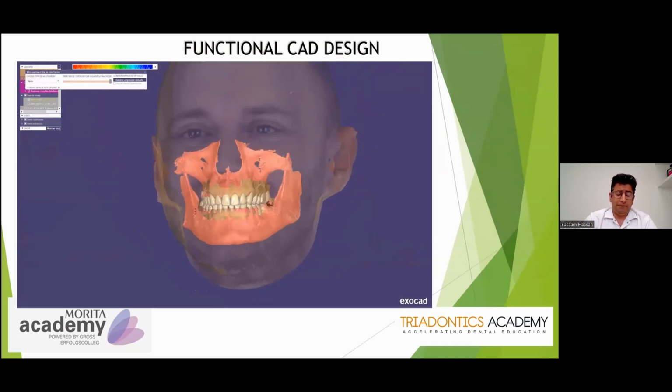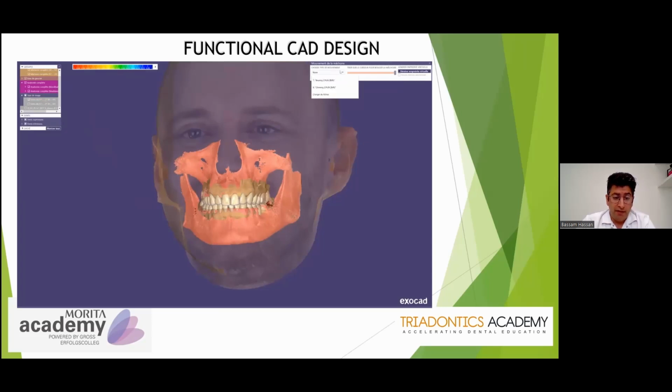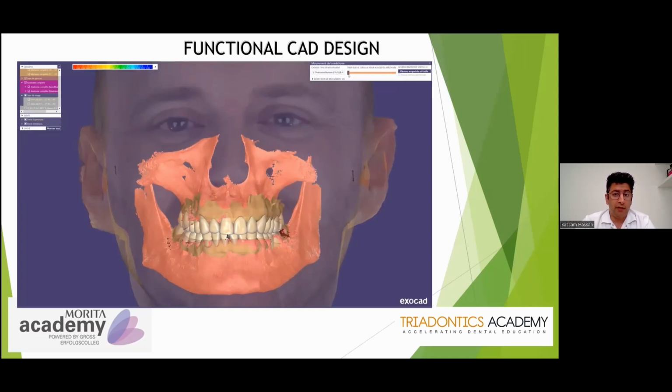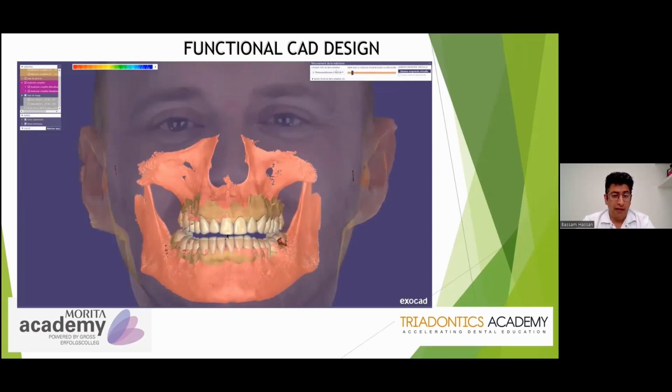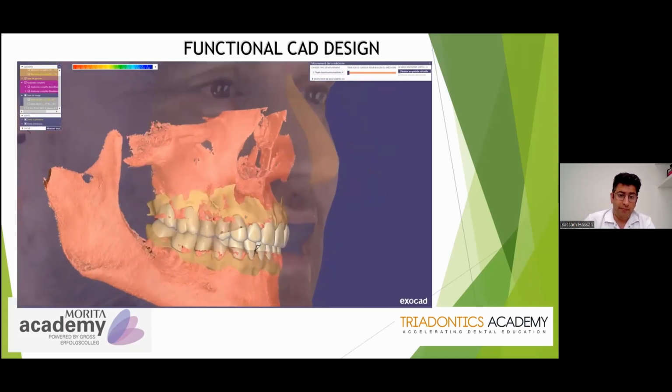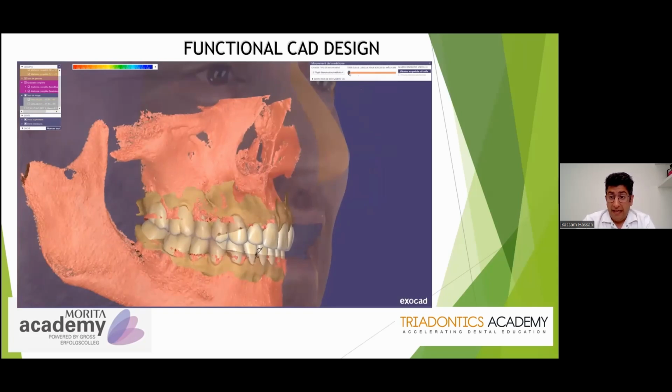This was necessary at the time to do good tooth wear rehabilitation, because you needed a way to open the bite and to check the dynamic articulation of the patient. And for that, we need to have a jaw motion tracker.